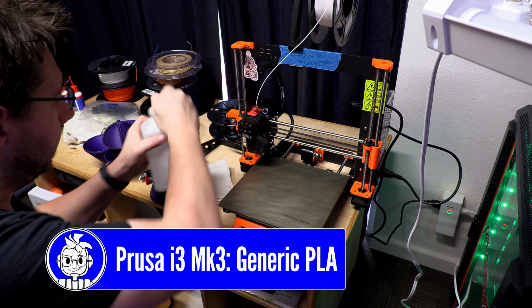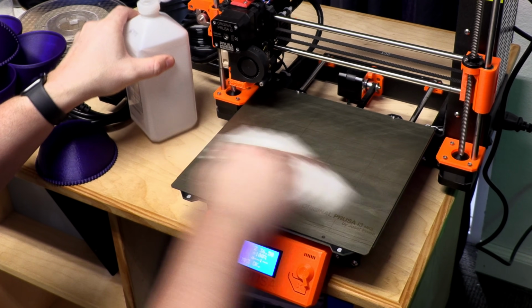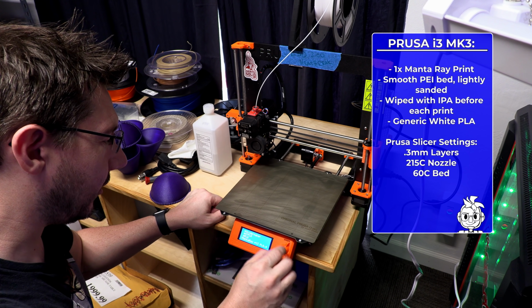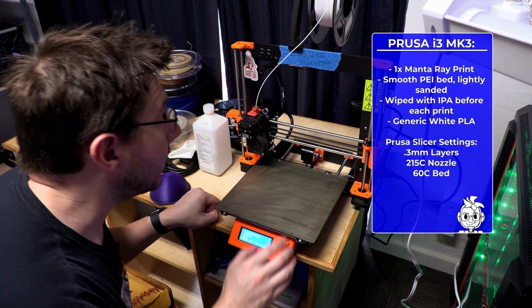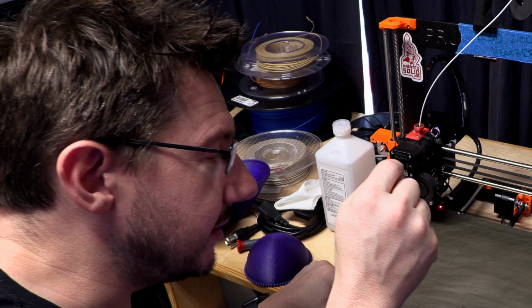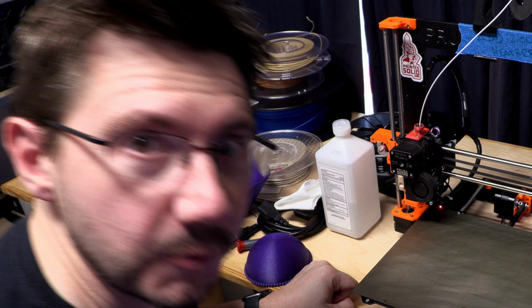First, what we need to do, of course, between prints, put a little bit of isopropyl alcohol on a paper towel, and rub it down. And then I go to print, and I go all the way down to Manta Ray 0.3. So I've got 0.3 millimeter layers, and I'm running with that PLA, and it takes about an hour and 10 minutes, hour and 15 to print, until the Manta Ray face shield model will be done. Let's move to the next one.